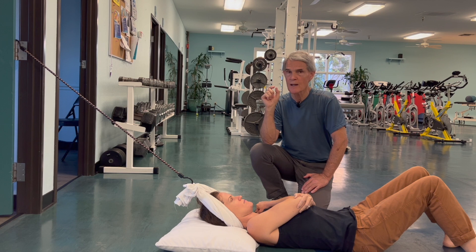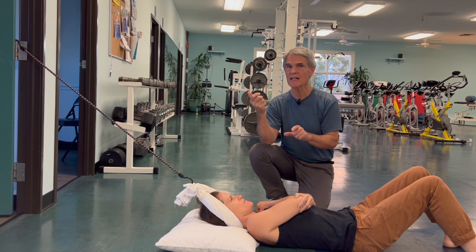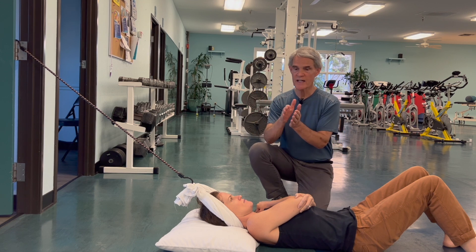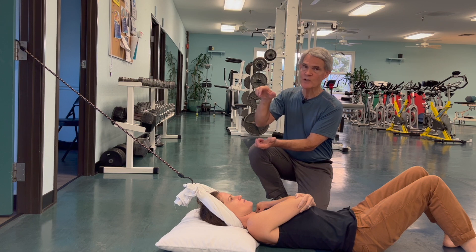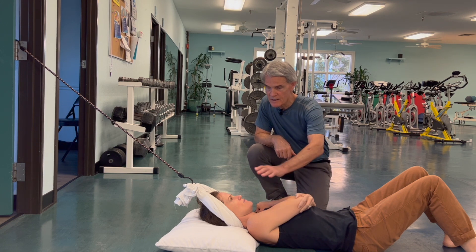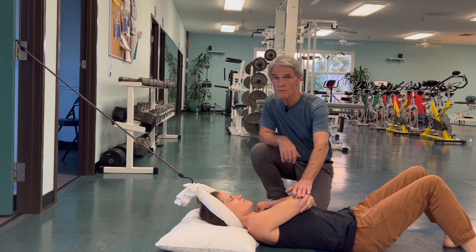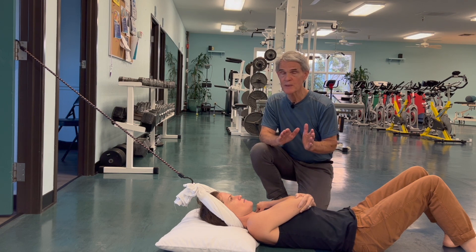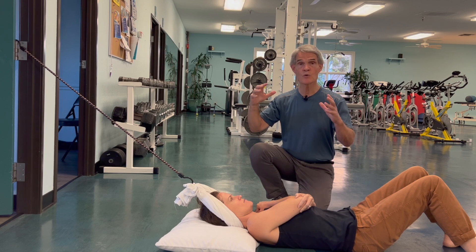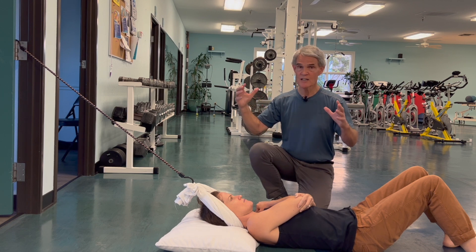Remember, you're looking to magnify the benefit of getting off your feet, not to apply a stretch to the connective tissue in your neck — because often the neck is vulnerable because the connective tissue has loosened, and you don't want to over-stretch it. The idea is gentle decompression, not stretch. The rule, especially with arm pain, is that you want the decompression to decrease the arm symptoms by about 50 percent. If you try to go for 100 percent, the extra space created around the nerve root can invite swelling to fill that volume.